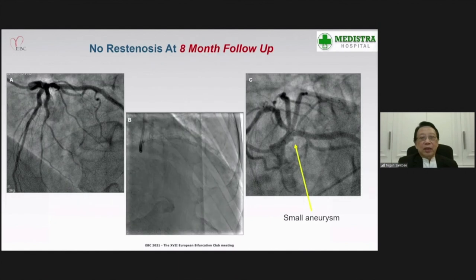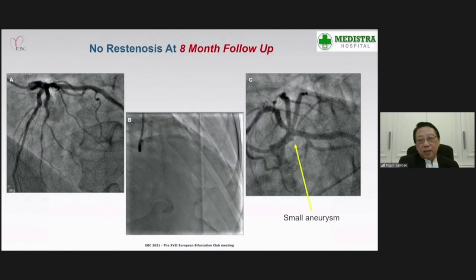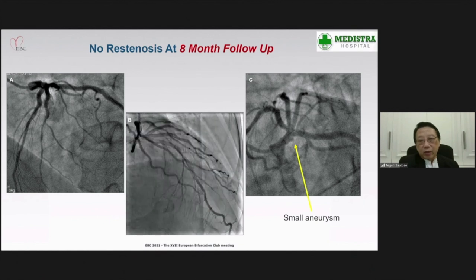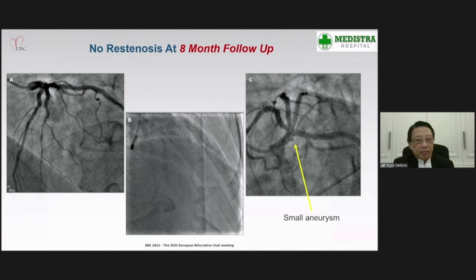At 8 months angiographic follow-up, there was no restenosis, and the distal left main showed a very small aneurysm, which is of no clinical significance at all.